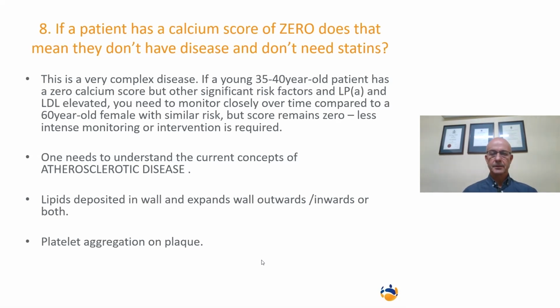Yeah, so again, similar question. I think this largely depends, one, on age, and two, on your overall risk factor profile. And so again, the MESA score becomes important. But just something to take note of: a 0 calcium score on the coronary arteries, in big studies, when they look at the entire vascular tree, with patients with risk factors, even though they may have a 0 calcium score, they may have disease in the carotid arteries, in the peripheral vascular system.